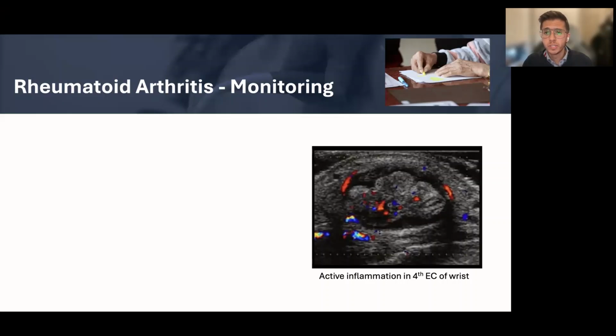So I used to work in a rheumatology clinic where we'd use ultrasound scans solely for hands, and we got lots of referrals from patients who possibly had rheumatoid arthritis, with weak autoantibodies, where you weren't really sure, and you pop an ultrasound probe on and you see active florid synovitis, and that can really help the diagnosis.